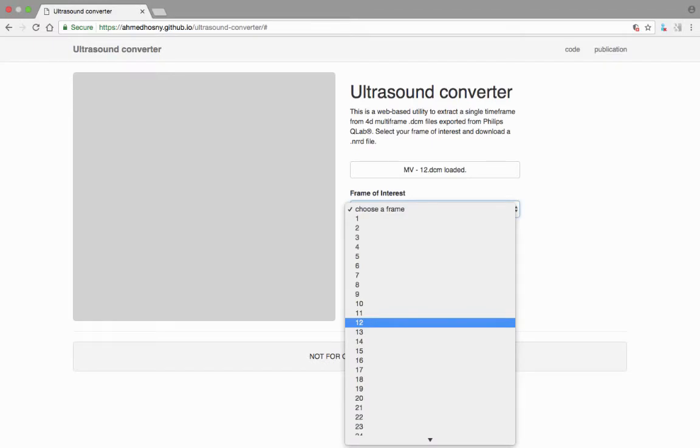The new drop-down menu prompts you to choose a frame. This is the specific frame of interest in the 4D dataset that you are interested in printing. The frame is generally a specific point in the cardiac cycle.